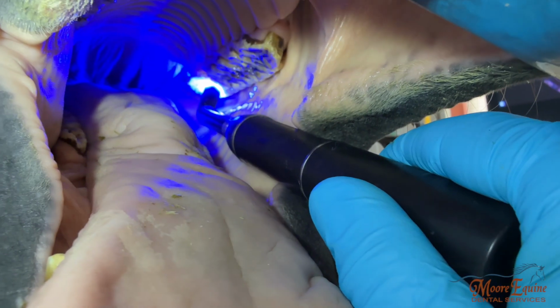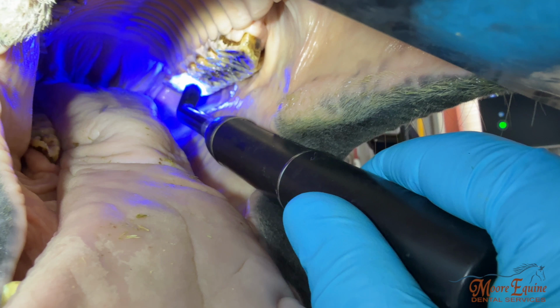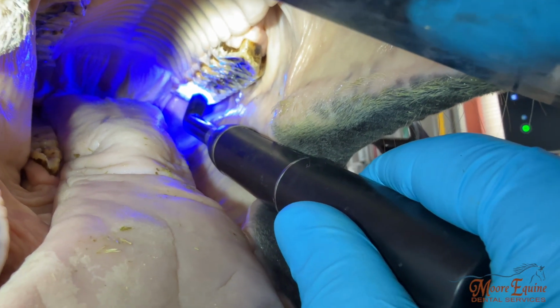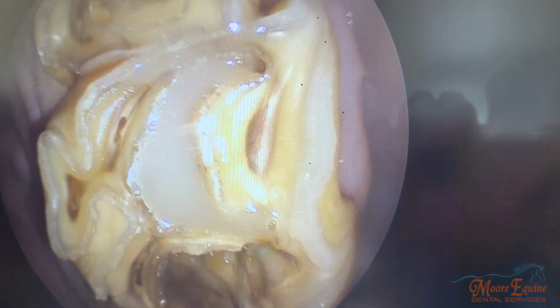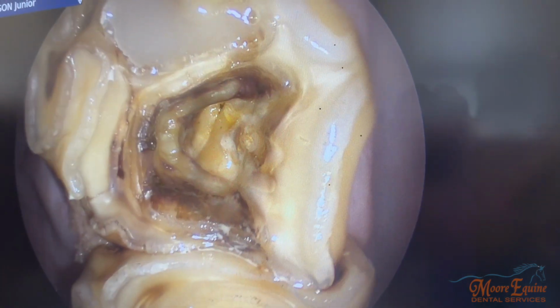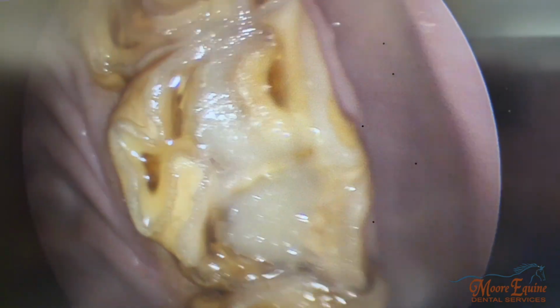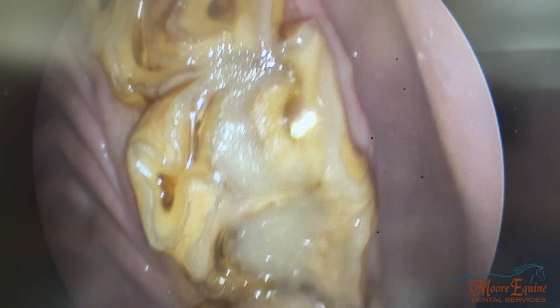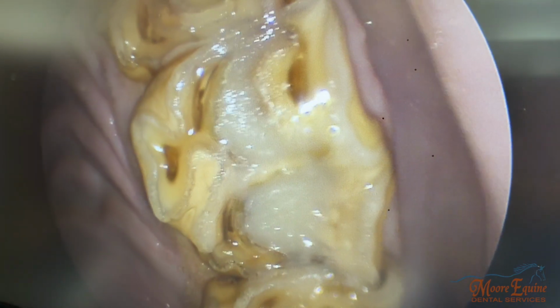Okay. So we use a UV light to cure the composite. It's a dual cure, so it's triggered by the UV, and then it's a chemical reaction as well. And so we've got the mesial infundibulum done, and now we're going to do the distal one. So here we can see the final product. That's what it looks like restored. So now it's going to wear basically the same hardness as dentin. And that tooth should be almost like new.